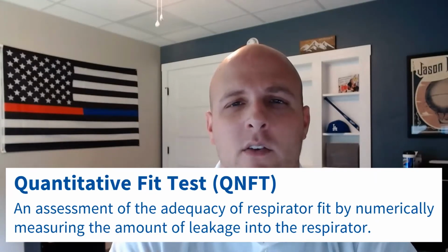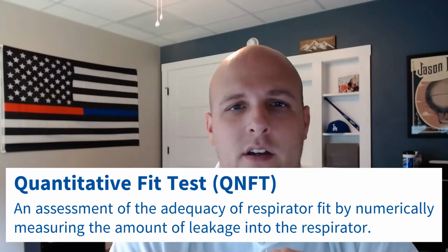A quantitative fit test, with an N, on the other hand, is going to be used with certain types of respirators, and you're going to use a TSI PortaCount. You can use an OHD, a lot of different models out there that you can use to do a quantitative fit test. But that's going to give you an actual number, and it's going to compare the ambient concentration of the substance that's outside your mask to the concentration of that substance inside your mask. It's going to give you that number.